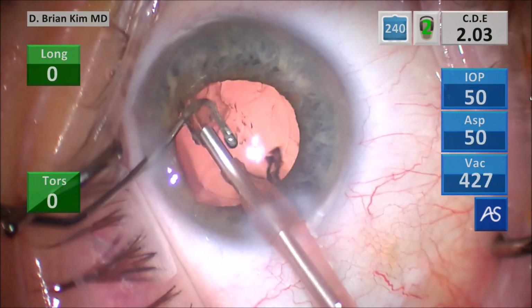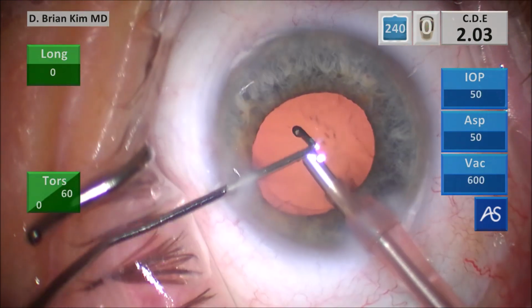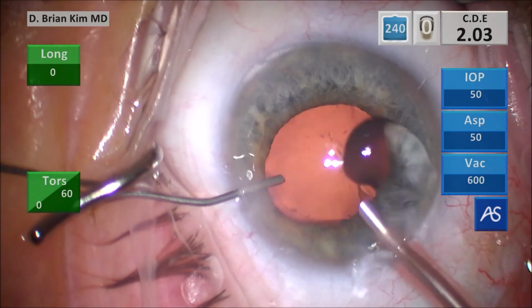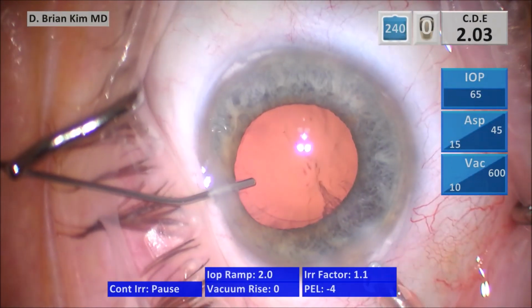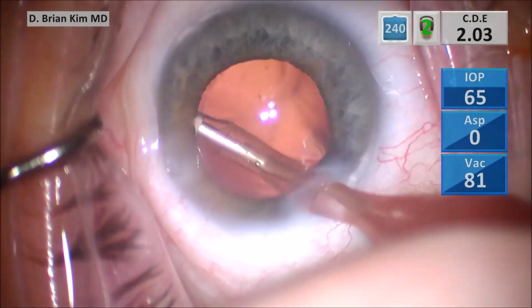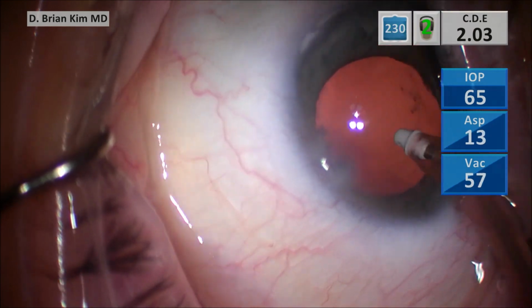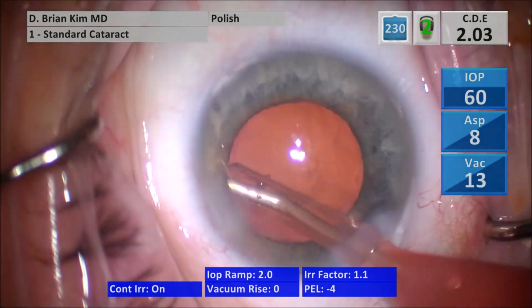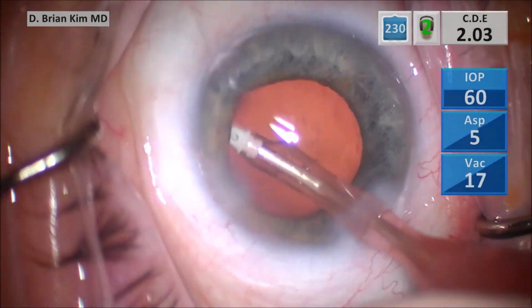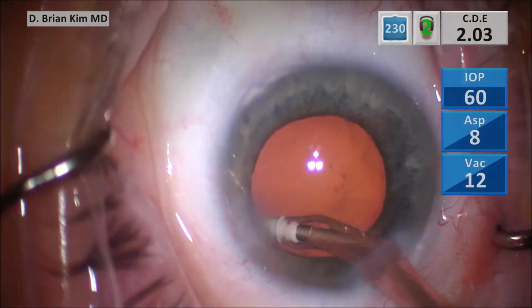Remember, when you're dealing with this situation, whether the pupil is small or big, sometimes it can happen during the case and it's unexpected. Again, you can always put in iris hooks, iris rings, and a variety of tools and devices. But again, I think it's rather overkill to use these devices with every case. And at least in the United States, having to use these devices are costly as well. And more importantly, those devices can cause complications in certain situations. And so it's very important to have exquisite control of your instruments and your hands during the case. And so that's why I feel like using these techniques are very, very helpful.